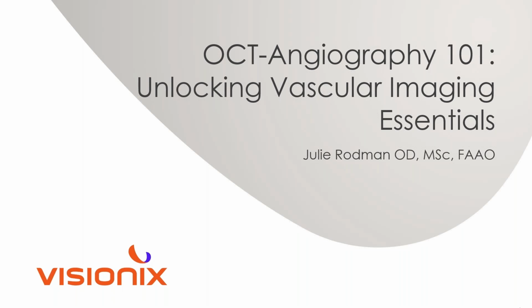It's always my pleasure to do any talks on OCT-Angiography because for those of you that know me, you know that I'm extremely passionate not only about OCT, but about OCT-Angiography. I feel like this is really the way that we can take the best care of our patients. So let's jump right in.